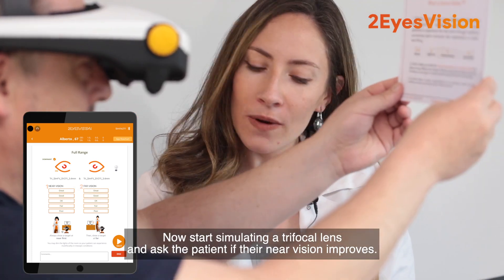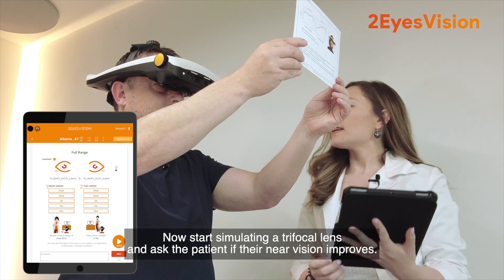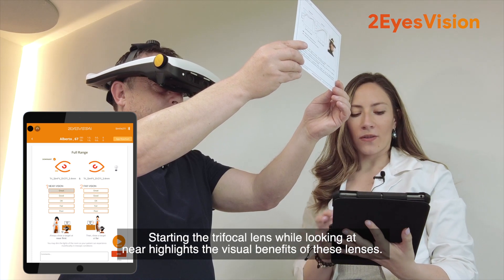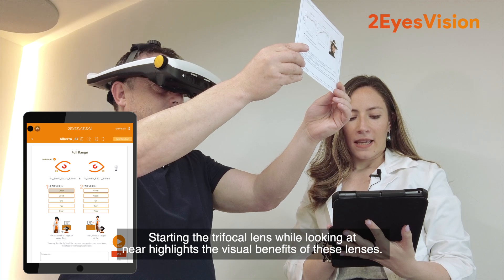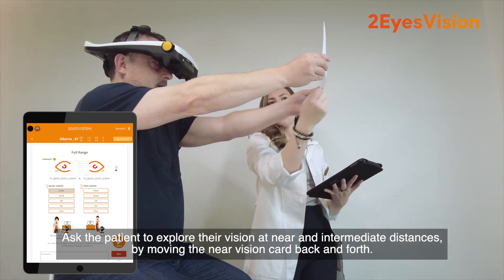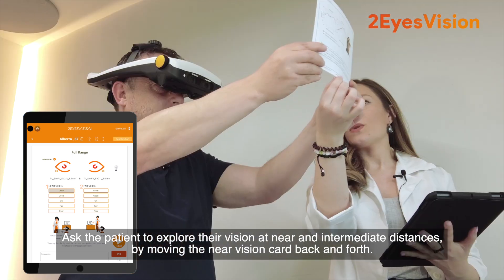Now start simulating a trifocal lens and ask the patient if their near vision improves. Starting the trifocal lens while looking at near highlights the visual benefits of these lenses. Ask the patient to explore their vision at near and intermediate distances by moving the near vision card back and forth.